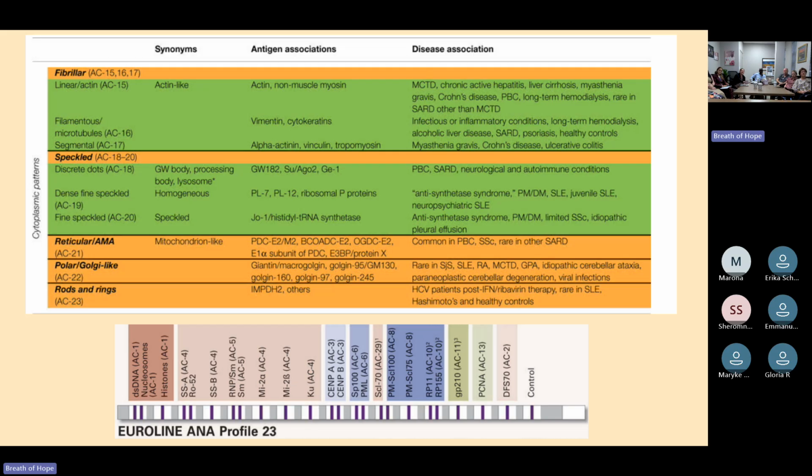These ones, 16, 17, 18, 19 and 20 are the ones with myositis. Some of these other ones, you're only really going to do a small breakdown because you can see you find them with all kinds of diseases. So what we normally would do is, if our ENA is positive, then we do at least an SSA and a double-stranded.